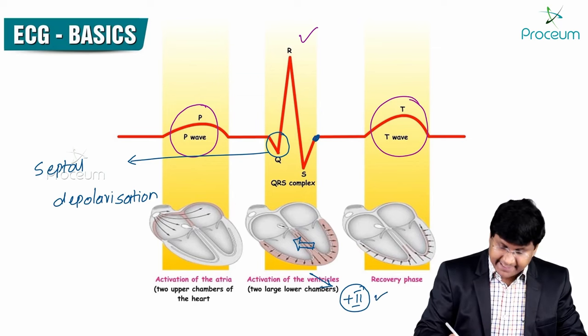And you see the other ECG. If you take the calibration here, how much is the calibration? It is just 5 small boxes. That means it is 5 mm. That means 0.5 millivolt. So this is your under-calibrated ECG.